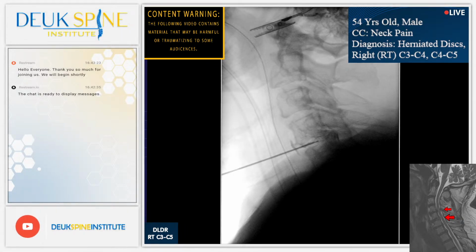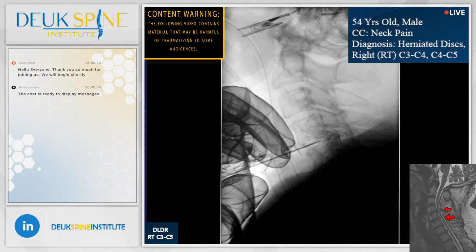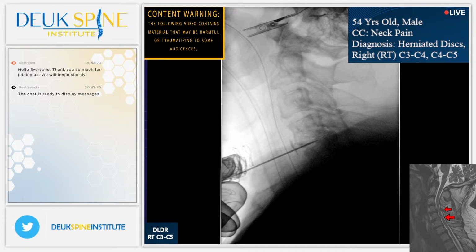Jordan, we got a rotational issue. Maybe Burndes can fix the rotational issue. Yeah, just a little bit, thanks. Incision. Let go. I've just made a 4mm incision in the front of his neck. Shot. Thank you. Shot. All right. Yeah, I've still got an off on orbit by 2 degrees. Shot. Maybe the other way. Shot.